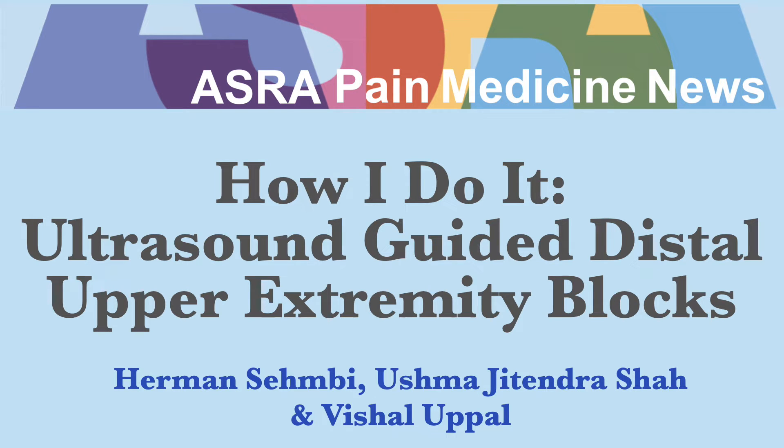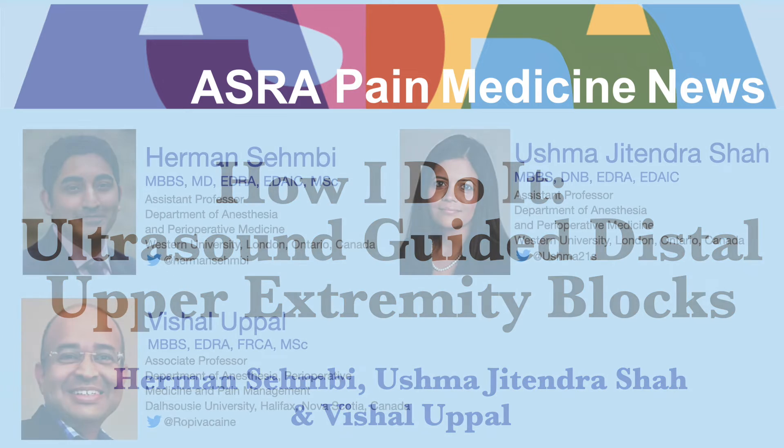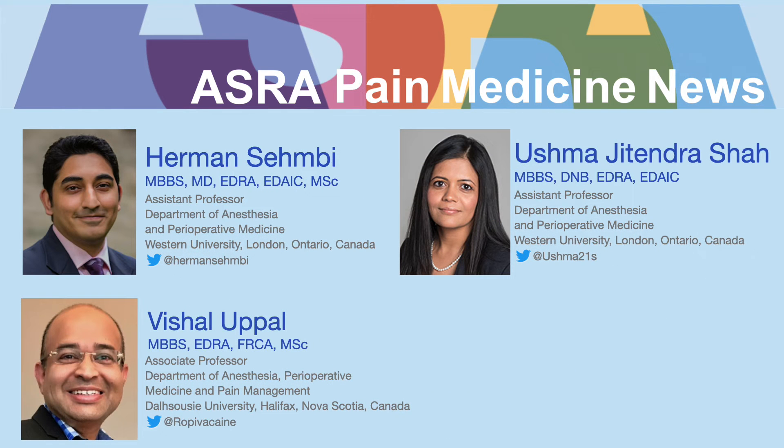In this video, we will review the ultrasound-guided distal upper extremity nerve blocks.